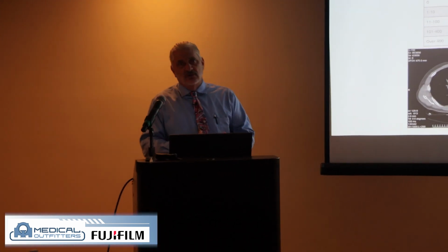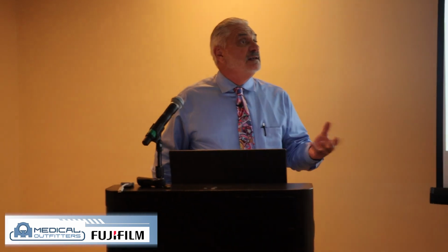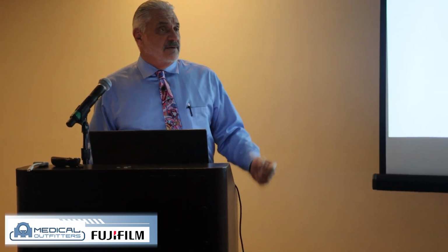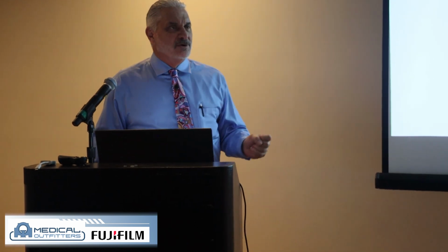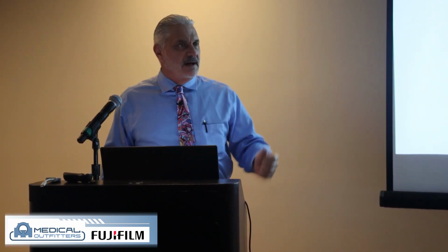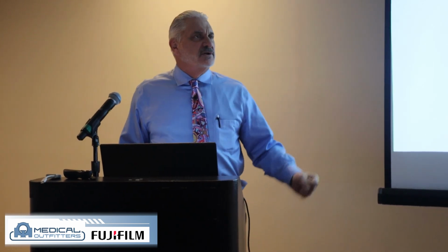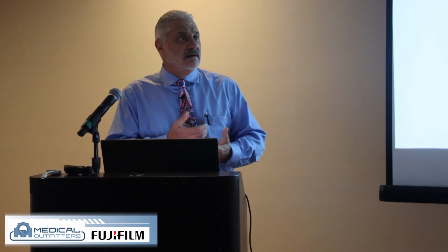This could lead to maybe having a nuclear study after that, maybe having a CT angiogram after that, or maybe really just going and having a cardiac catheterization from there. More or less, I use the report to put the fear of God into a lot of these patients, right? They might not have a high score, but they might be a diabetic with high cholesterol and they're running a 200 calcium score. These are reversible things so that they take care of themselves.